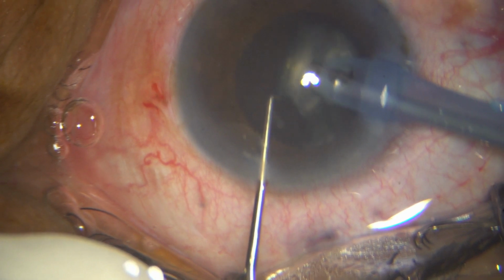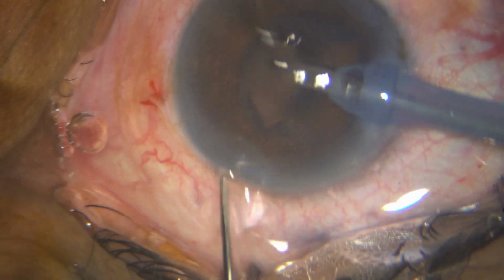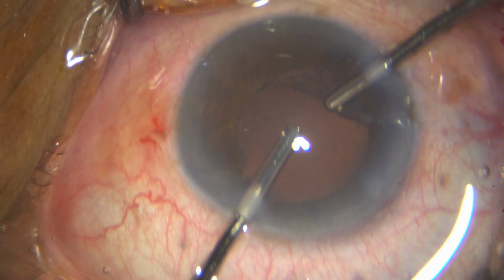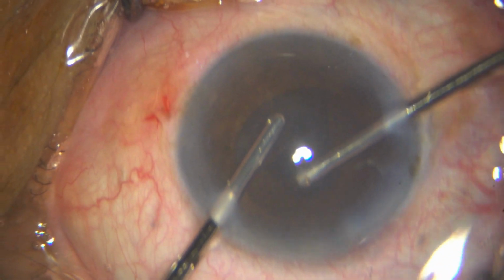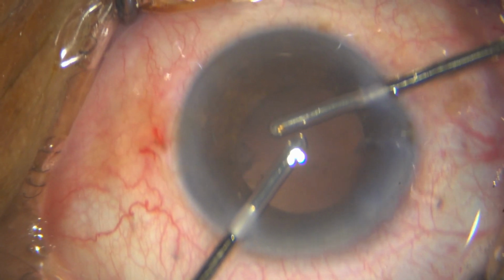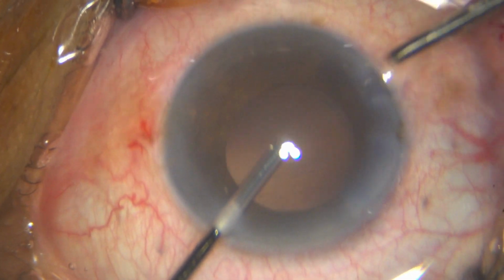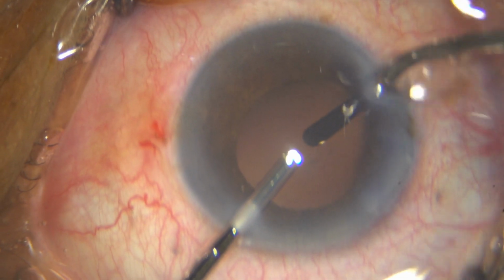Once that's done, I then take my bimanual and aspirate all the remaining cortex. It's important to take this out in sheets. Have a mental image, go around the fornices in a clock-like fashion, and make sure you take out everything. There are little bits and pieces on the posterior capsule which I clean with my posterior capsular mode.